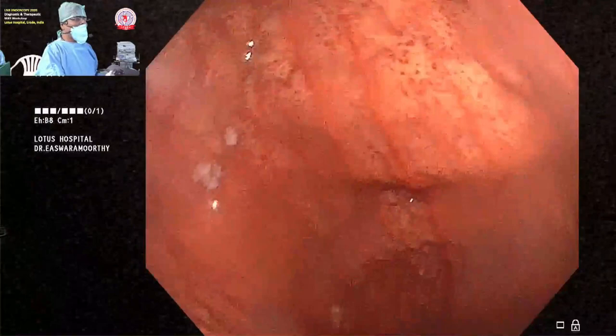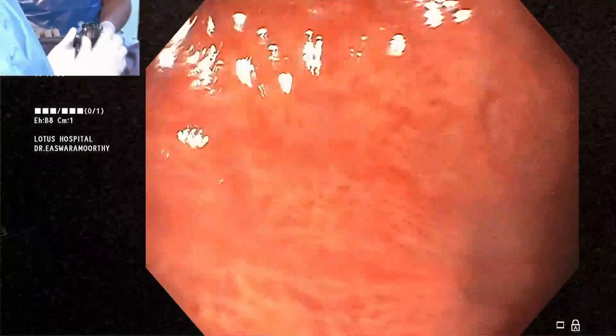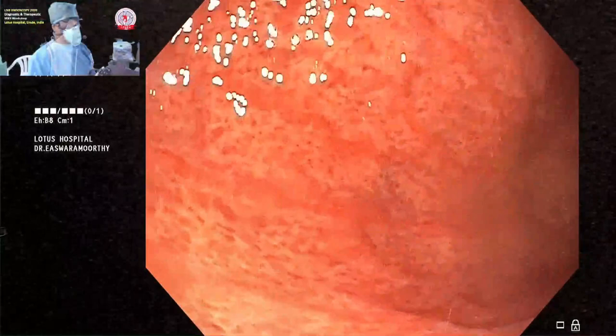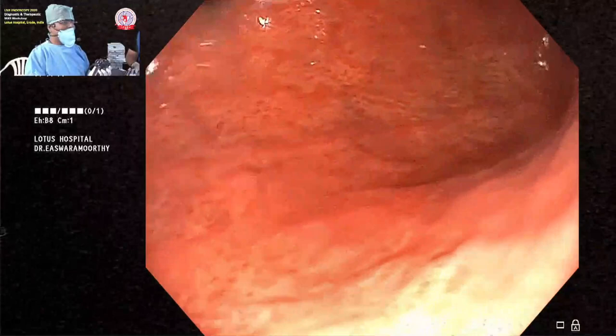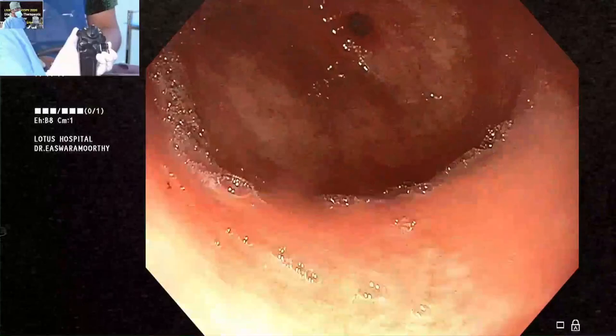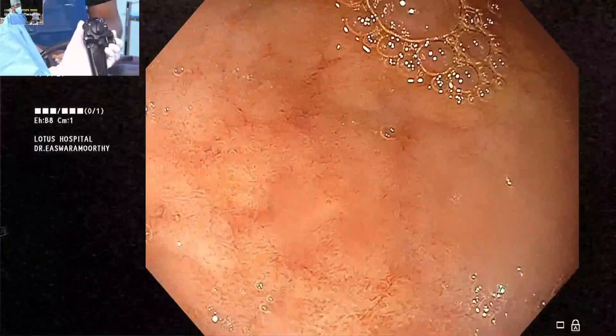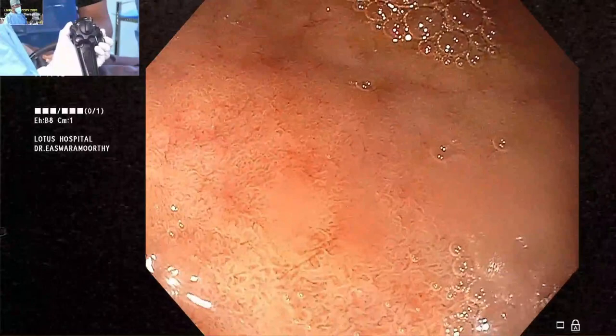On entering the stomach, you can see congestive gastropathy — the mucosa looks like crocodile or snake skin. As soon as you go in, once the rugal folds disappear, apply clockwise torque on the shaft and turn the big wheel toward you, then push forward. You will see the pylorus — aim to bring it right to the center of the screen. When the scope is straight and facing the pylorus centrally, you will be able to enter D1.